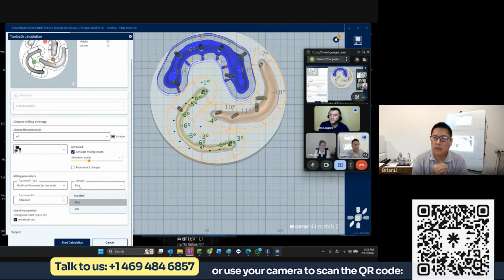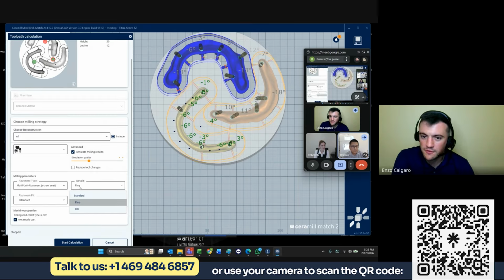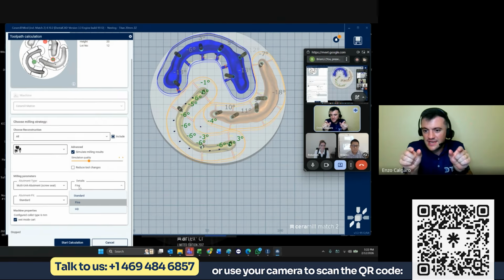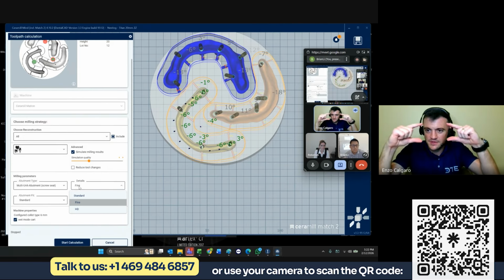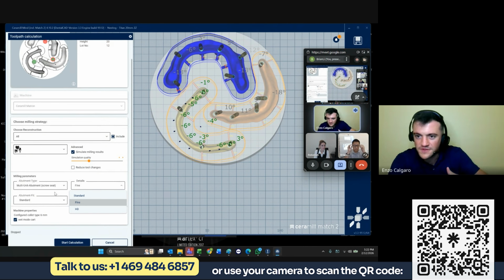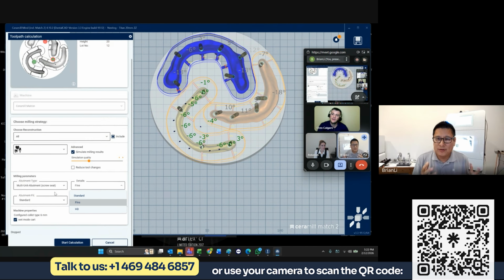And then multi-units, Brian, what would you recommend for when you have a bar like this and you have multi-units, then you need the passive fit, and the sides are not really important, right? When you're passive, you're hitting the bottom and the top. So would you go plus 50 or would you leave it as standard? I have not done enough to give a confident answer on that. I would just say that you can do both.